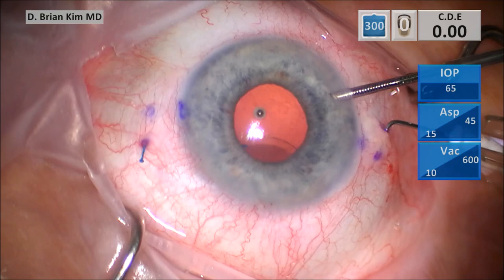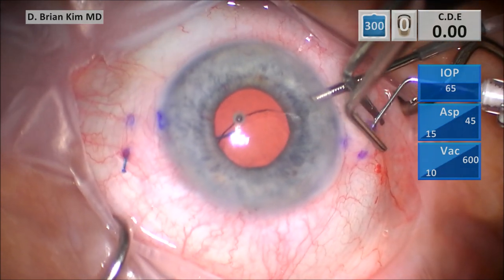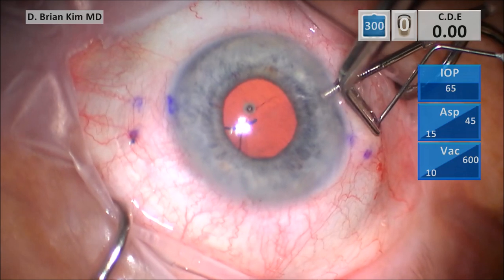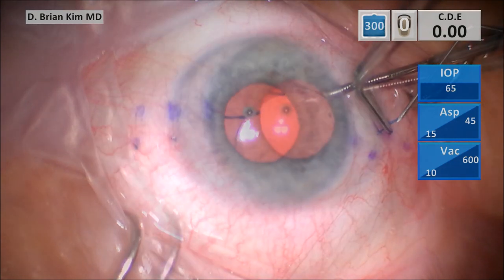And so as you see, I'm going to pull out the right side haptic. When you see me pulling this haptic out, you will see how much tension is being applied to this left haptic. As I'm pulling it, it's stretched even more — you see how stretched that left haptic is.